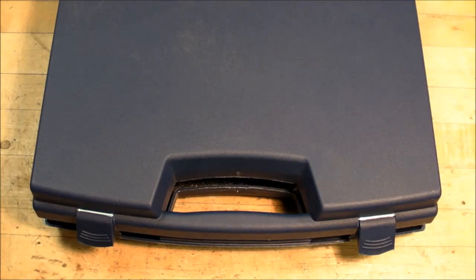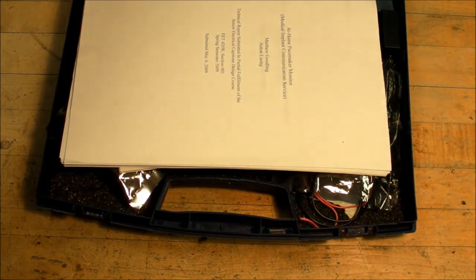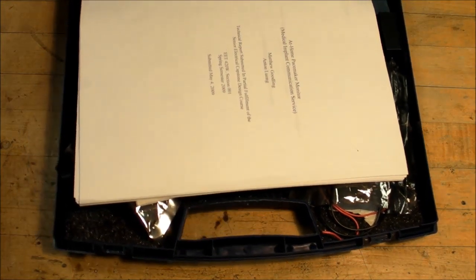Hi everybody. I just got done watching Mike Harrison's recently uploaded video in which he tore down an implantable defibrillator, and I figured I would make a teardown video of a pacemaker that I happen to have.